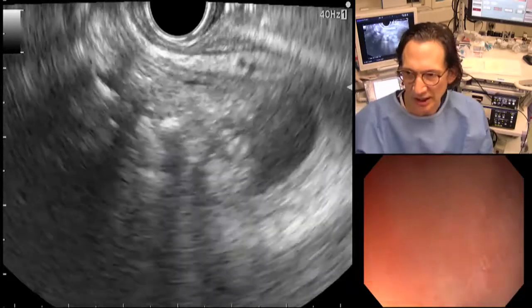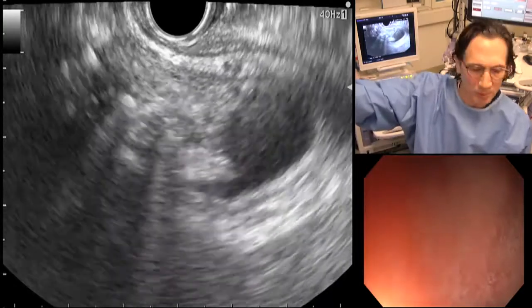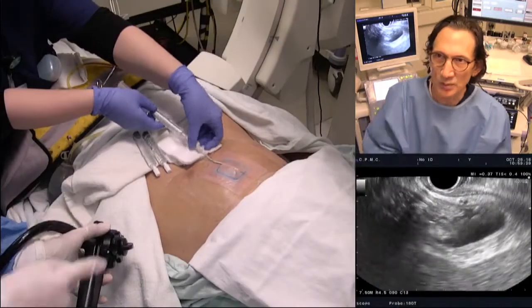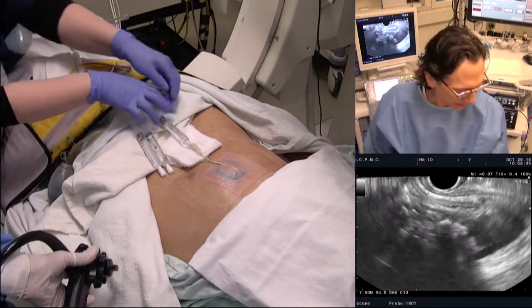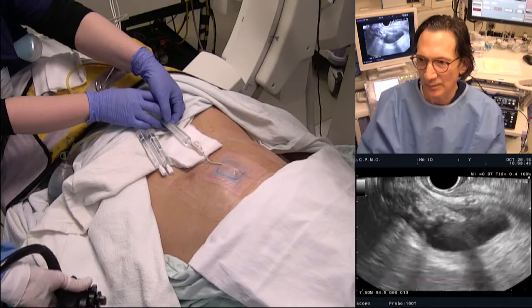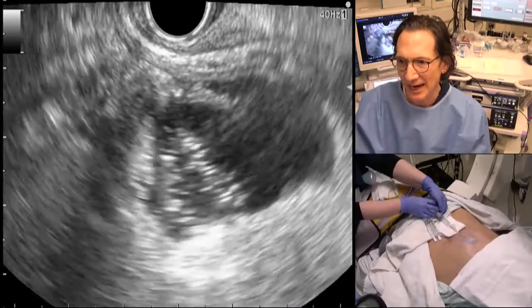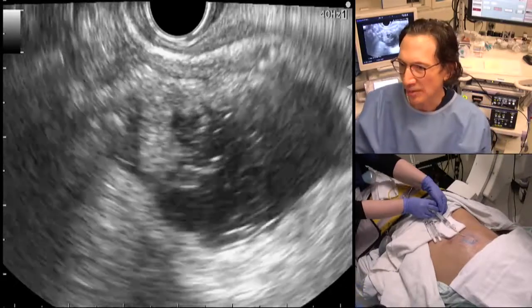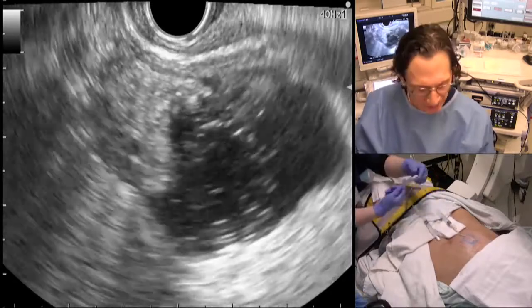So Julie now is just going to take a moment to disconnect. And we can actually show that if we can have our room camera show what Julie's doing. So she's disconnected the bag from the cholecystostomy tube. And she's going to inject some sterile saline or water into the gallbladder. And we should see it fill and confirm that we're in the gallbladder. So start injecting, please, Julie. Do you see it go in there? You see the bubbles filling in, right? So this is very nice because it gives us a very nice confirmation that this is the gallbladder, and it's distending it a little bit more for us and will make it a little bit easier. Fill it up a little bit more.